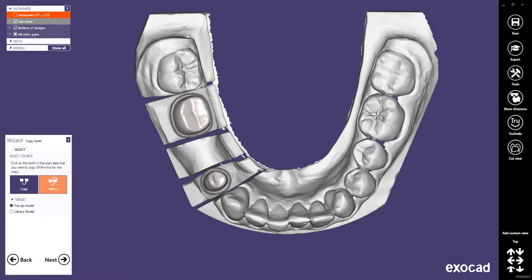You can also copy several teeth at once to a single pre-op model, for example, to quickly copy a bridge. Once you have selected the first tooth, you can use Control and left mouse click to add and select another tooth. This allows you even to select a complete block of teeth for your virtual pre-op. And why not even add the adjacent teeth? They probably might help us in the placement of the pre-op scan.